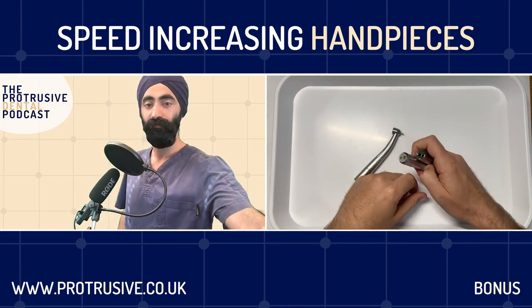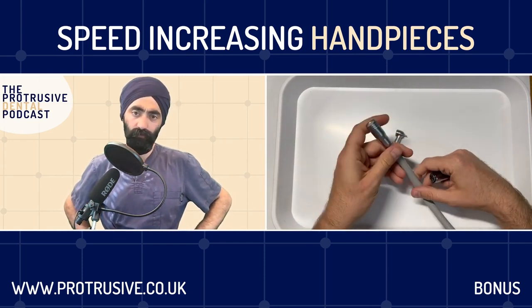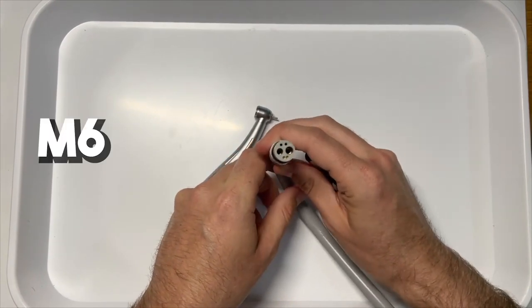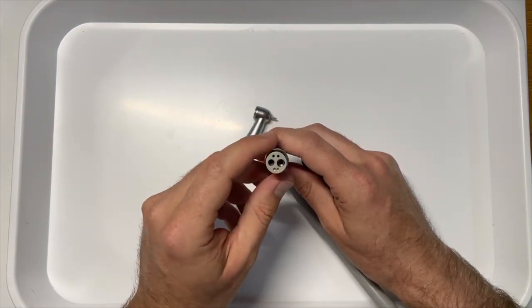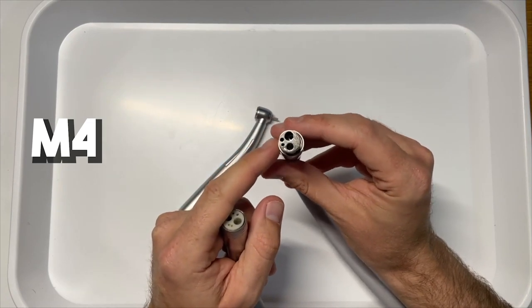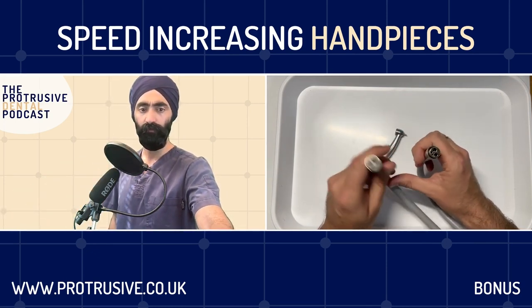So for guys on audio, I'm going to talk you through this, but I've also got a video to show people. The hoses that come off your regular dental chair - there are actually a couple of different types. The most common in the UK is called an M6, which means it's got six holes in it: two big ones and four on the side. That one has fiber optics that come through it.